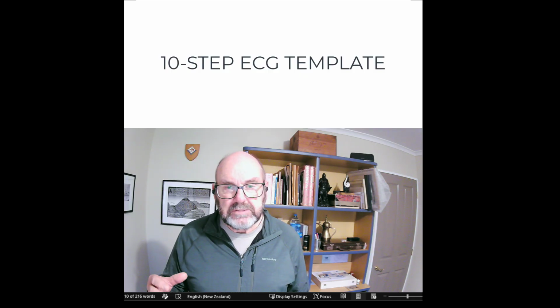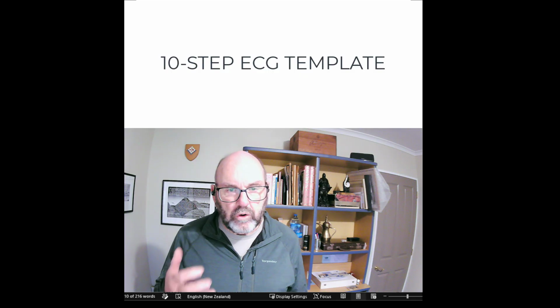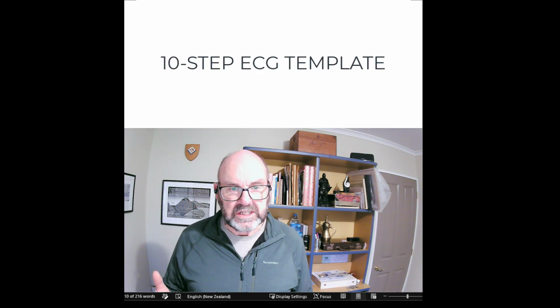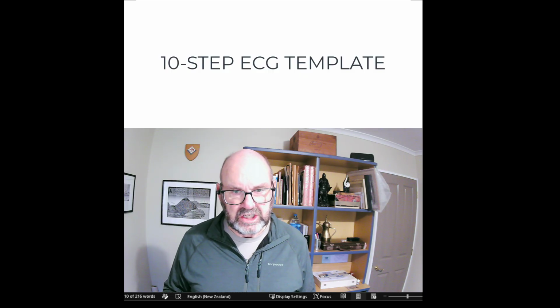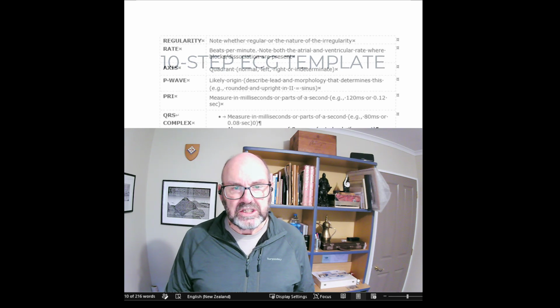Secondly, is how you're expected to process and display knowledge in the majority of the formative and summative assessment work for this paper. For the block course exercises, this is the way in which we're going to process the practice ECGs. So, let's explore the expectations of this model.